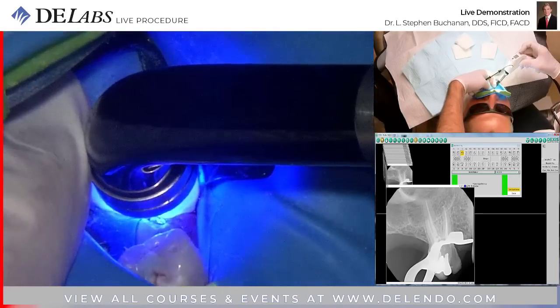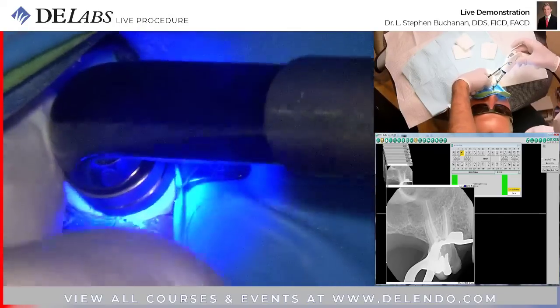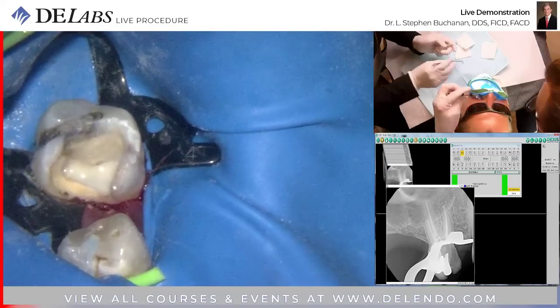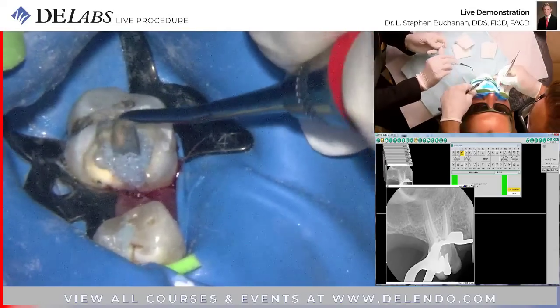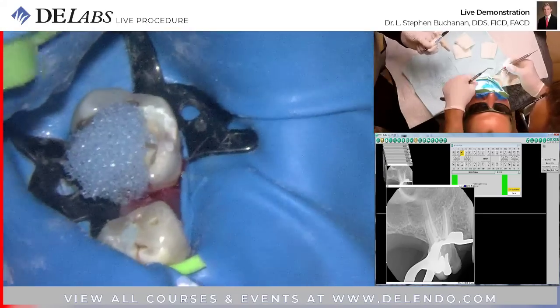We're going to shorten his tooth for him. Dude, we're done. I told you. I know. It's like 4. Yes. Last one we finished at 6. That was not good. Too bad. Let's see. Yeah, a little bit.